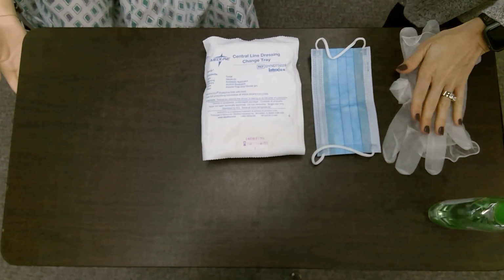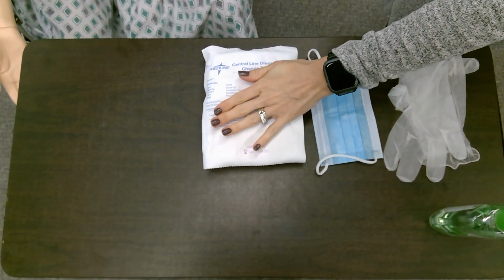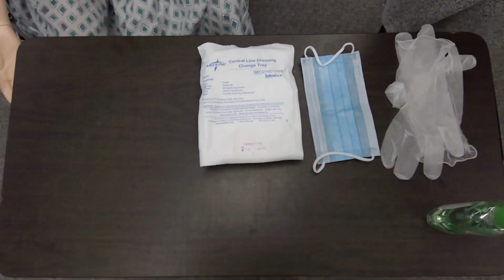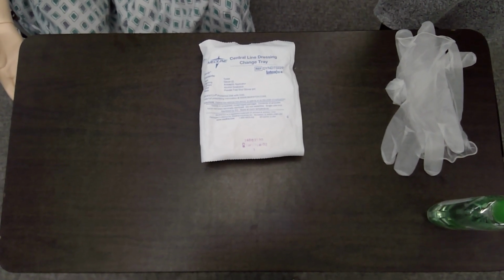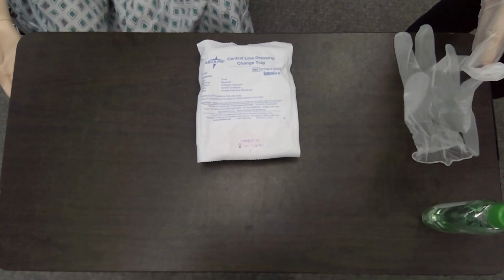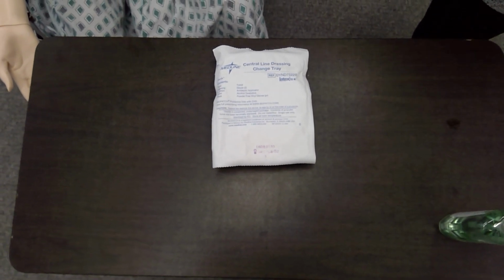So for this, I need a pair of clean gloves, an extra mask, and then a central line dressing tray. There is another mask in this tray. You do need to mask yourself as well as the patient. So I'm going to go ahead and apply my mask. I'm going to put clean gloves on, and I'm going to remove the old dressing.